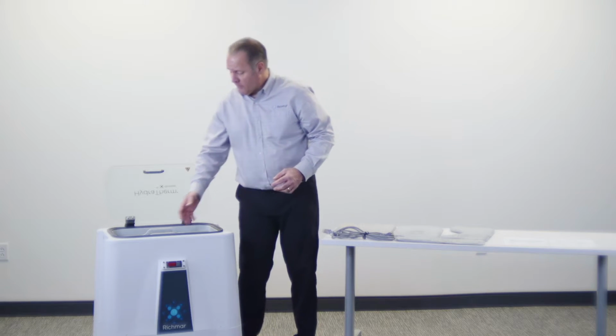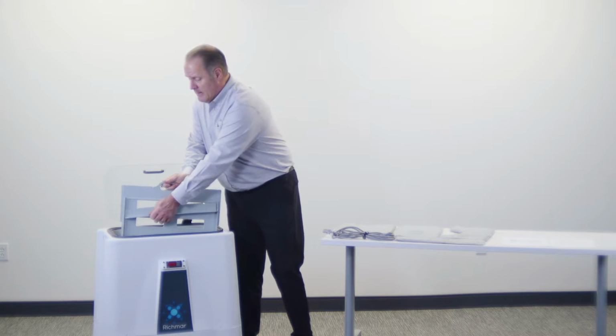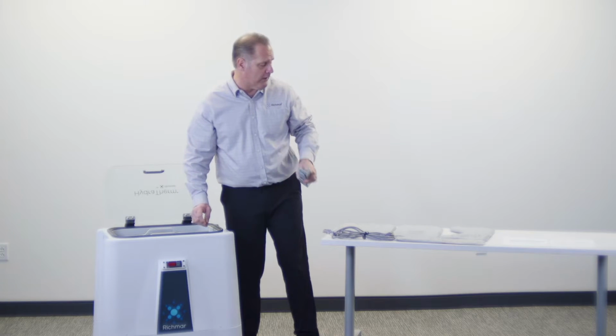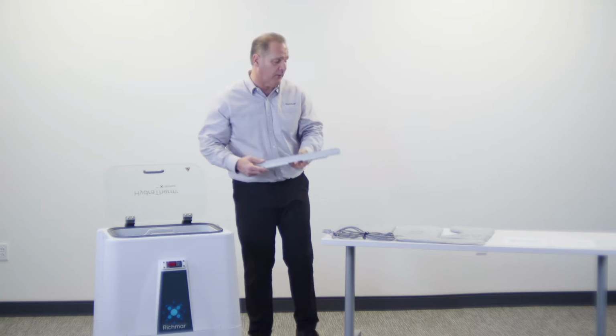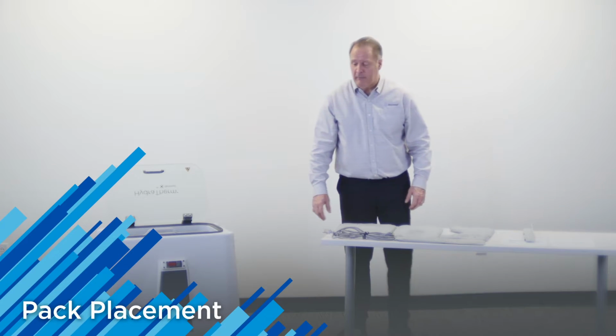My hint from Heloise is then to pull all the different clipping shelves out of the system and store them. You'll end up with 2 additional clip-on shelves. You'll then configure your unit.